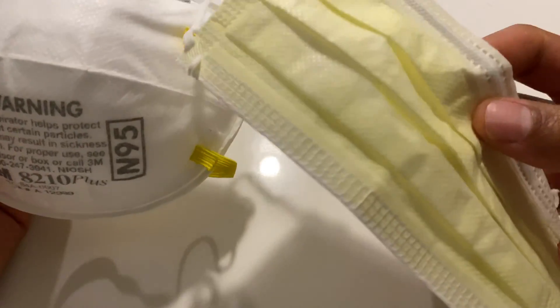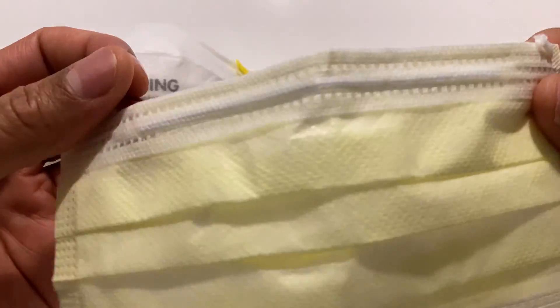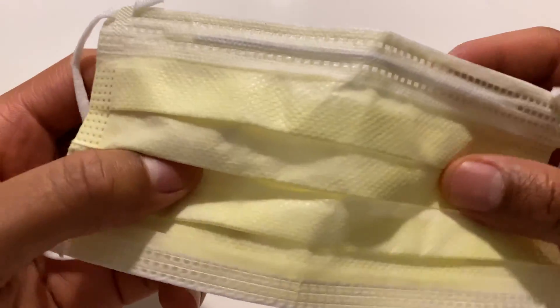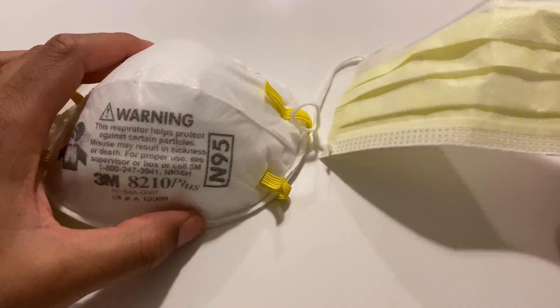N95 mask versus this mask right here. This is your basic mask that people put on, thinking it's going to protect them. However, it does not protect as well as an N95 mask.